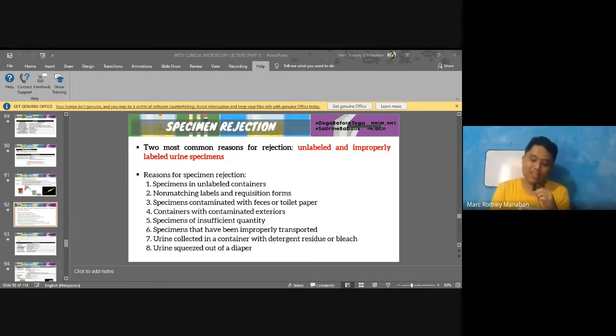Alright. Okay, so for beginners, the best thing to do as an intern is to consult your medtech. Ipakita sa kanila ang specimen, mo ask dito, ma'am, sir, okay na ba ito na ma-process? Remember that in a way, ibalin pa man siya sa tube. So if gamay ra kaayo ang specimen, expected na dili na siya ma-process sa machine, kaya the machine would require you a higher volume.